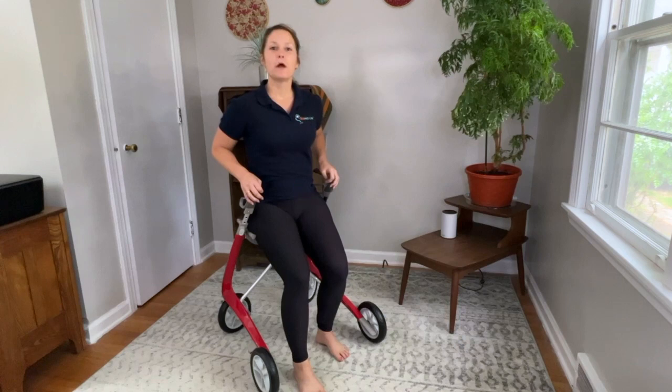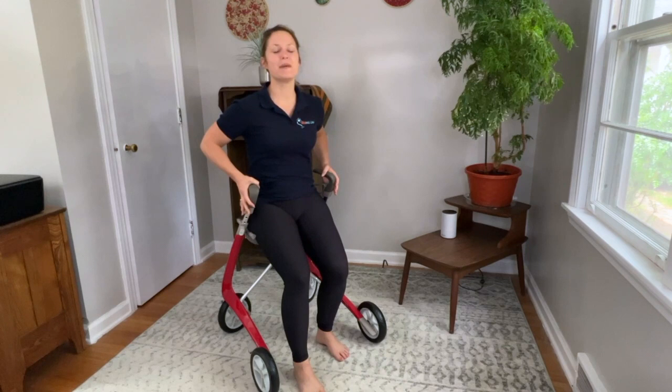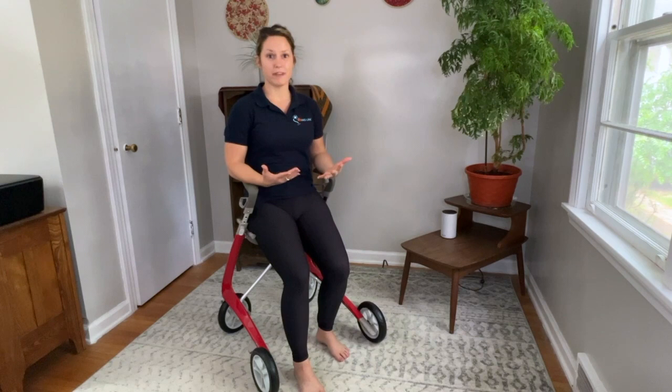Before we get to the exercises, I do just want to state a disclaimer that most rollator companies, including Byacre, which is where this beautiful rollator is from, do not suggest that you exercise on them. In fact, Byacre says not to. However, I feel like if you have proper guidance and are safe enough to do so, it's actually a really great tool. So just keep that in mind as we continue.